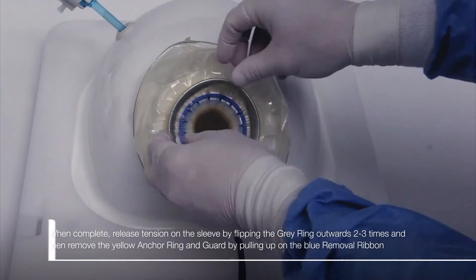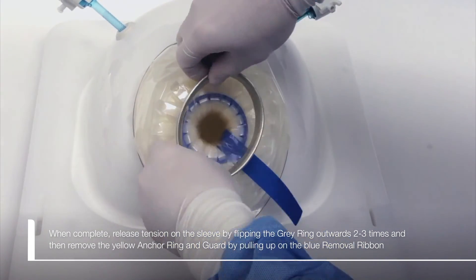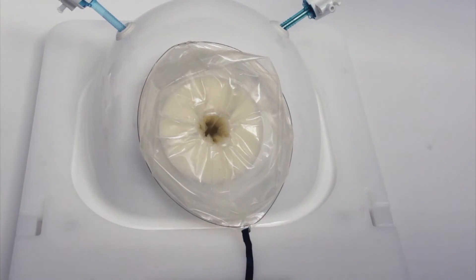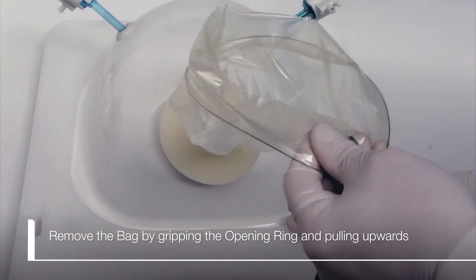When complete, release tension on the sleeve by flipping the gray ring outwards two to three times, and then remove the yellow anchor ring and guard by pulling up on the blue removal ribbon. Remove the bag by gripping the opening ring and pulling upwards.